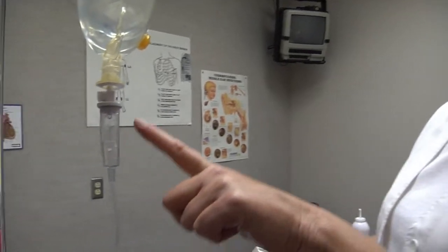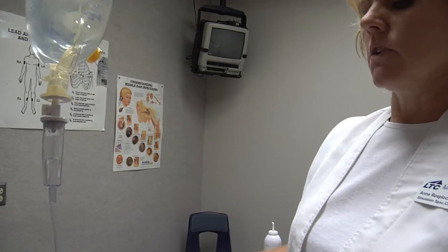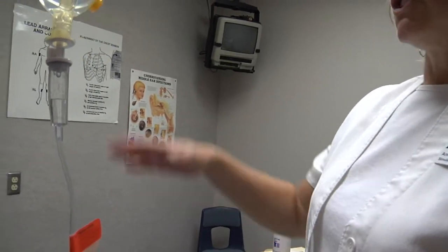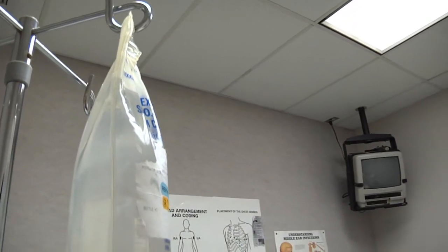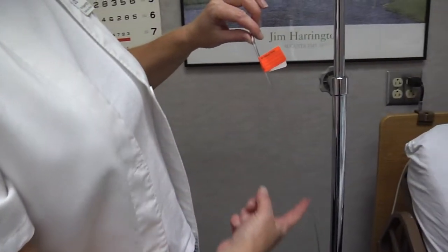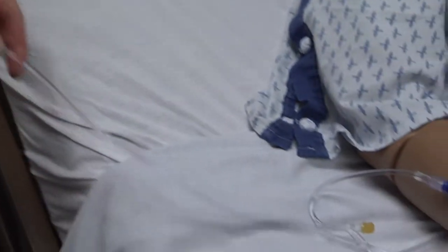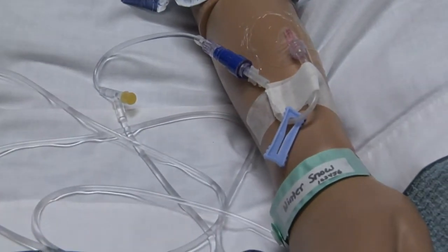So in our drip chamber, we've determined that the solution is the correct solution. It's dripping at the correct rate, and about half of the chamber is full. And also we'd want to make sure that the IV bag itself is at least 3 feet above the patient. And so that looks like a pretty good distance as well. So then we're going to proceed down from the drip chamber. We're going to go down and check the tubing itself. We're making sure that there are no kinks or coils in the tubing. The tubing should be gently coiled on the bed, but no kinks in it.